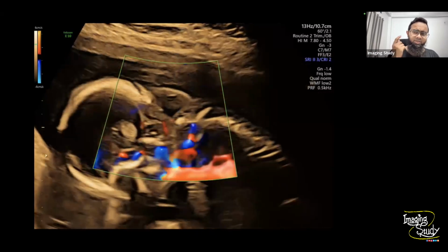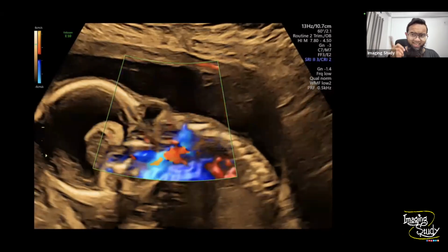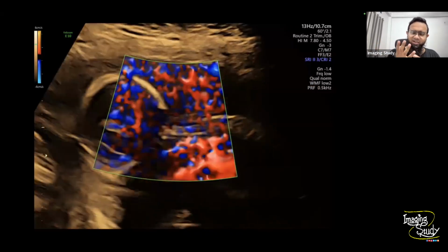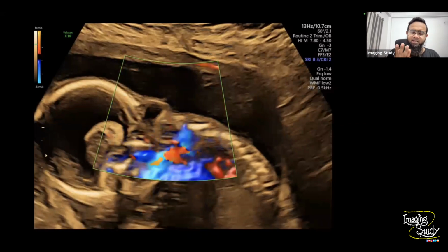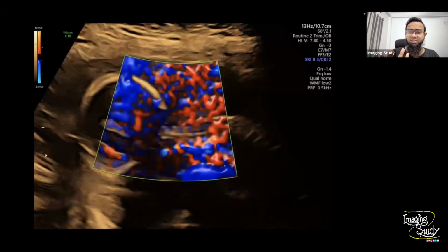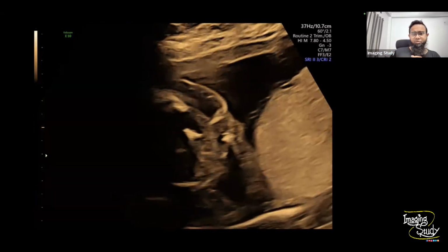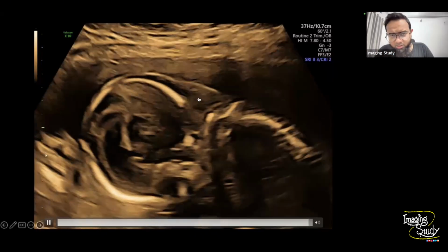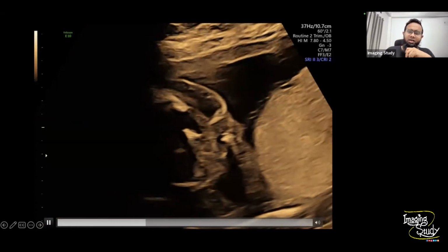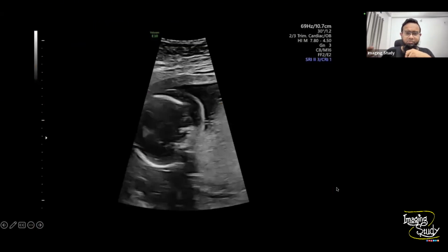But if you see cystic hygroma with a single umbilical artery, you'll go for trisomy 18, that is Edwards syndrome. So in this patient, we want to solve whether the patient has some renal defect or a single umbilical artery. That will be a very important finding. So let's jump into this patient again. This is the cystic hygroma. We are still looking at that part, and we couldn't conclude the diagnosis about the cerebellum.